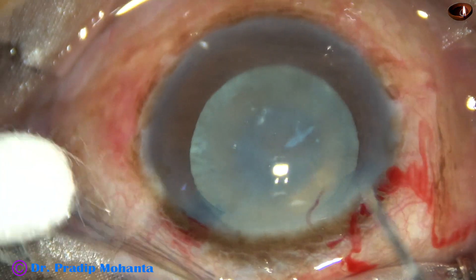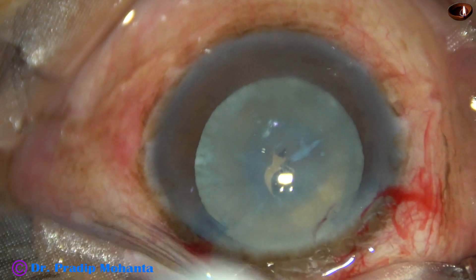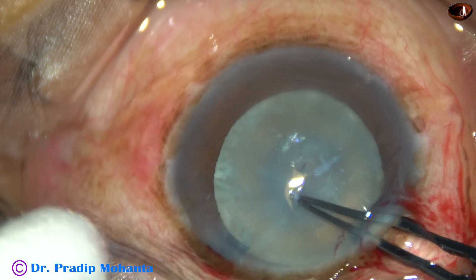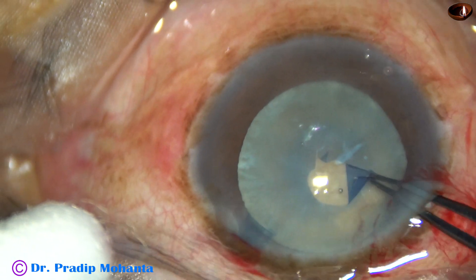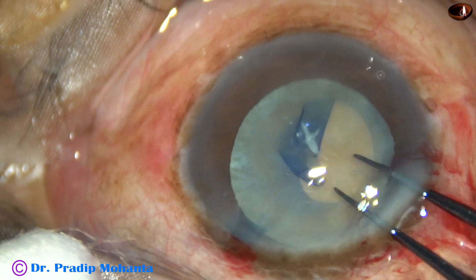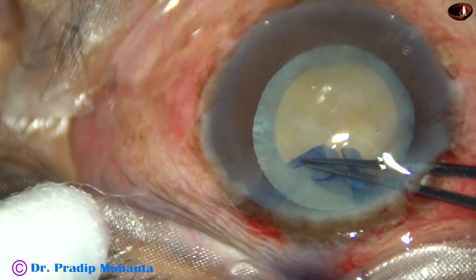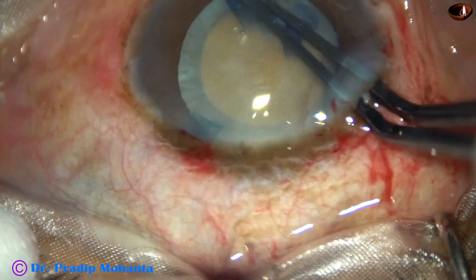In such cases we can do capsulorhexis on the go. I made a flap — a capsular tag. Now I hold this capsular tag with utrata forceps and go anti-clockwise. Since the cataract is quite hard, I'm going to make a large rhexis; the size will be about 5.75 to 6 millimeters.